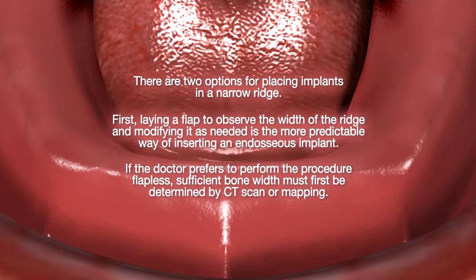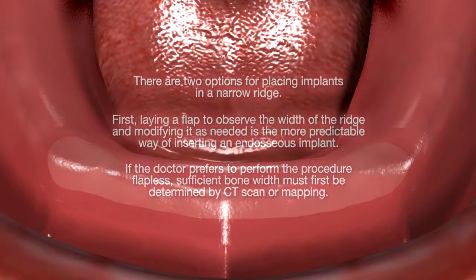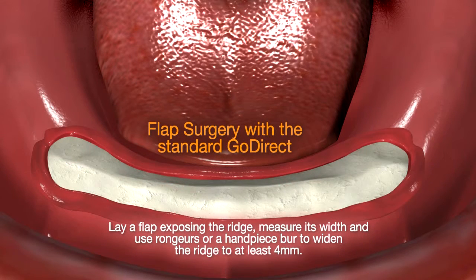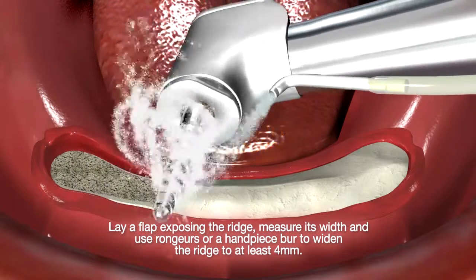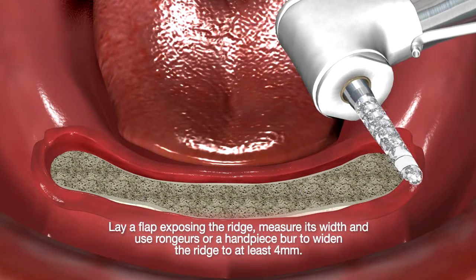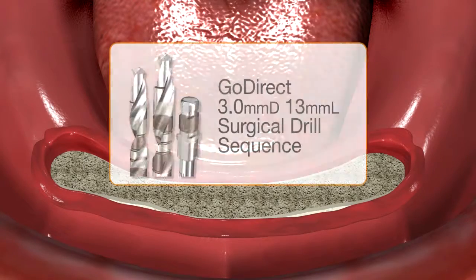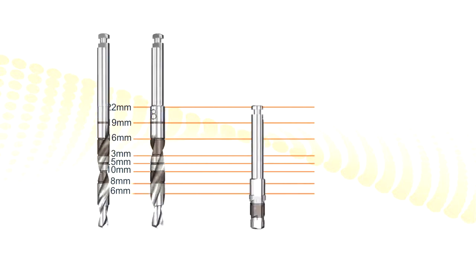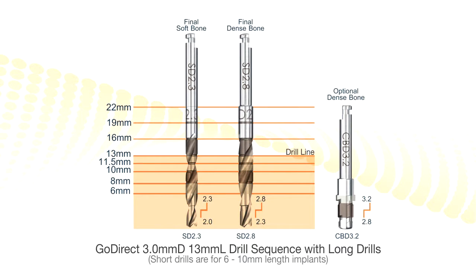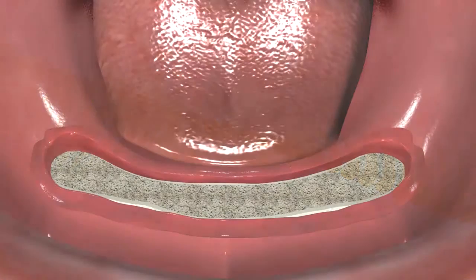There are 2 options for placing implants in a narrow ridge. Either lay the flap or do the procedure flapless. So let's look at the standard flap surgery, which is what I recommend for most situations. It gives you the opportunity to flatten the ridge as necessary. This is for the 3mm GoDirect implant, 13 millimeters in length. There's the 13mm line on these drills, and this is a crestal bone drill for very dense bone, and when you turn it in reverse, it'll flatten the top of the ridge as well.